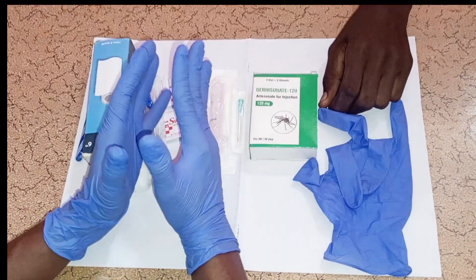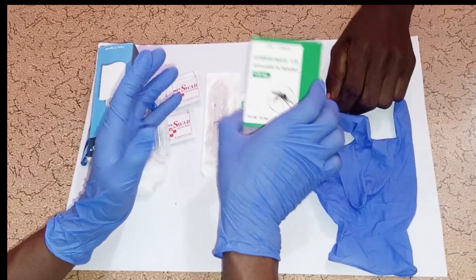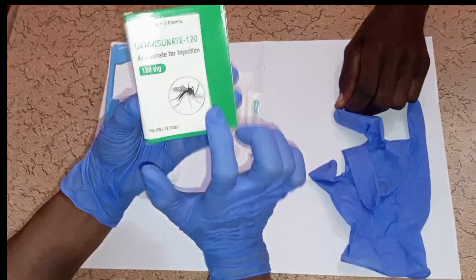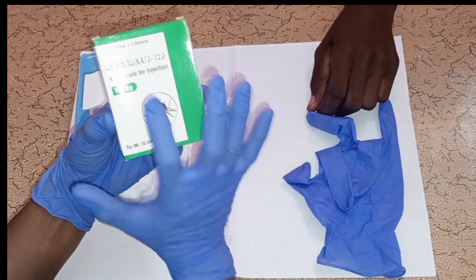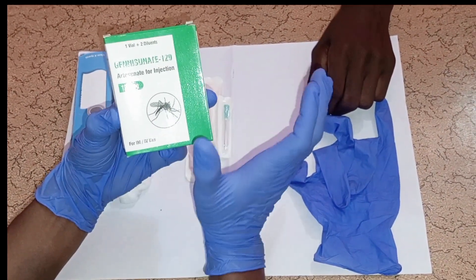Hi friends, welcome back. In today's video, I'm going to show you how you can simply prepare and administer IV artesunate for injection for the treatment of severe malaria. I just want to show you how you can simply dilute and prepare artesunate injection step by step.